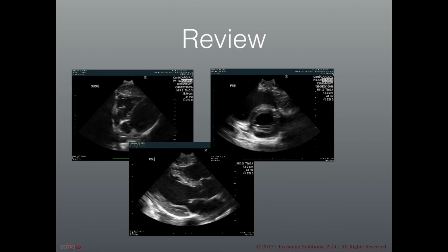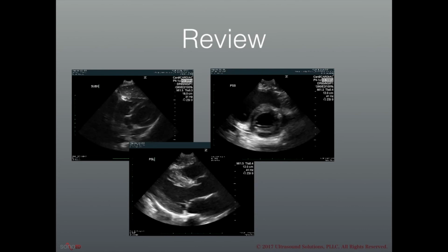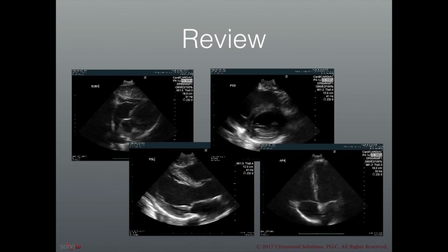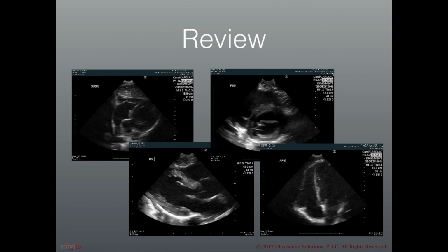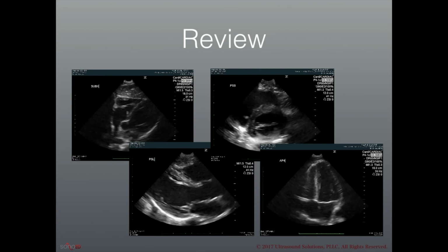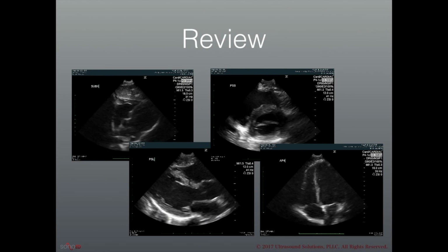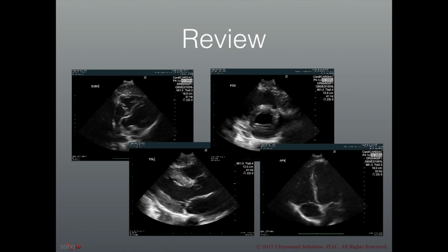The left ventricle is round, it's centered, and the right ventricle is crescent shaped and to the top left of it on the image. And here's an apical 4-chamber view. The interventricular septum is perpendicularly oriented in the center of the screen. The 2 ventricles are in the near field, with the right ventricle on screen left, the left ventricle on screen right, and the adjacent atria just deep to them. This is how each image should look if it's obtained correctly.